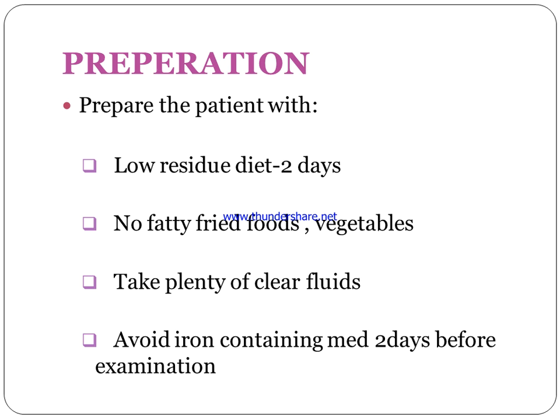Patient preparation for the barium enema. Firstly, prepare the patient with a low residue diet. This means we provide the patient a low residue diet 2 days before the procedure. Provide no fatty fried foods or vegetables. Take plenty of clear fluids. Avoid iron containing medicines 2 days before the examination. So for 2 days prior to the examination, the patient uses a low residue diet, no fatty fried foods, and avoids iron containing medicine.